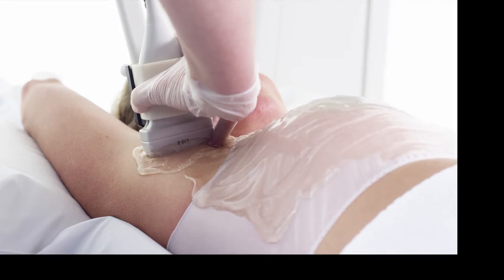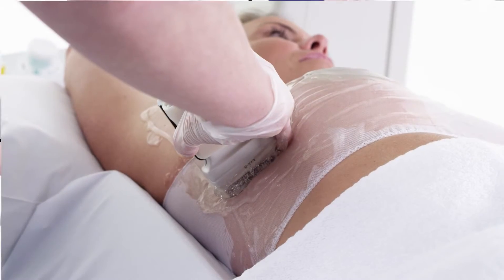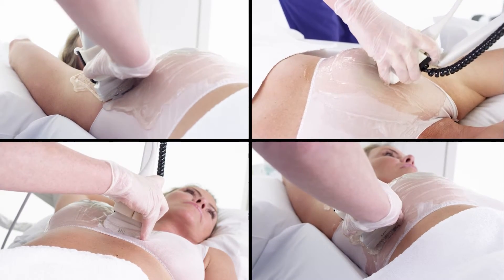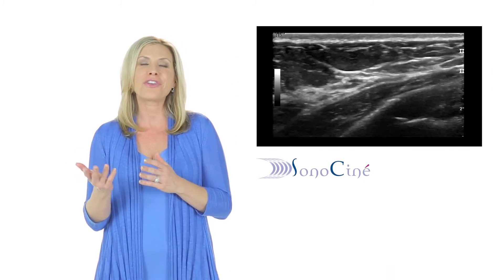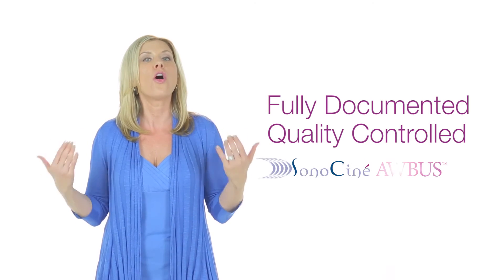The Sonos Cine ABUS exam provides whole breast coverage, which includes your underarm, clavicle, in between your breasts, the sides of your breasts, and all the way back to your chest wall. When the exam is finished, the Sonos Cine ABUS system will have captured between 2,000 and 5,000 images to form an ultrasound movie, or Sonosine, for your radiologist to review. The system is designed to provide you with a fully documented, quality-controlled examination of all your breast tissue.